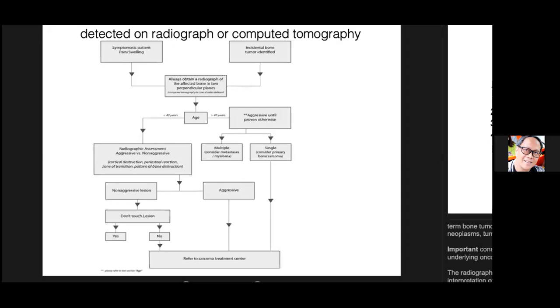It takes around 30%, some literature will say maybe up to 50%, of bone loss to be able to register as an area of lytic destruction in radiographs. So it takes some time for that to happen, of course. But for earlier detection, you will have to turn to a modality that will show the finer details much earlier, like for example, MRI.